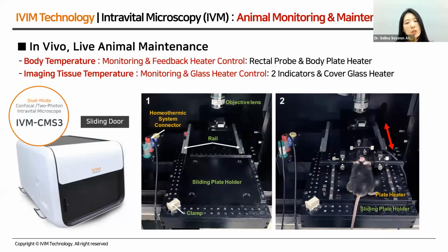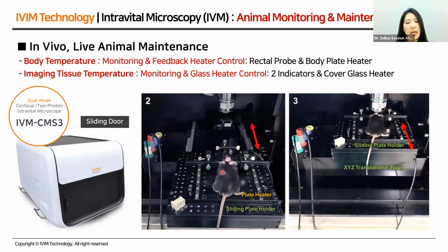So this is the translational stage for mounting the mouse model. Every accessory can be connected to the connector on the left. And we can slide the stage in and out before and after mounting.